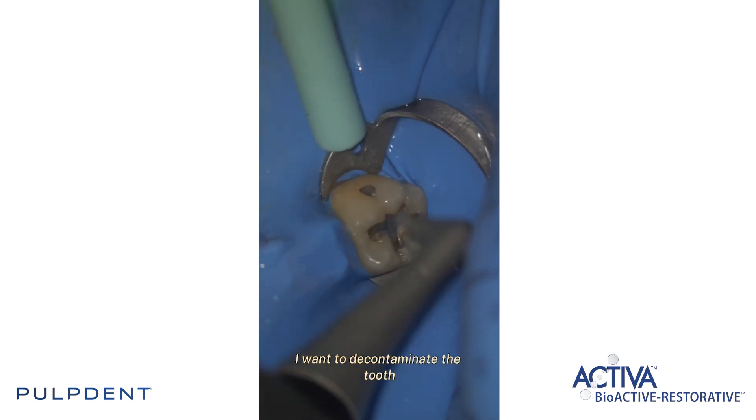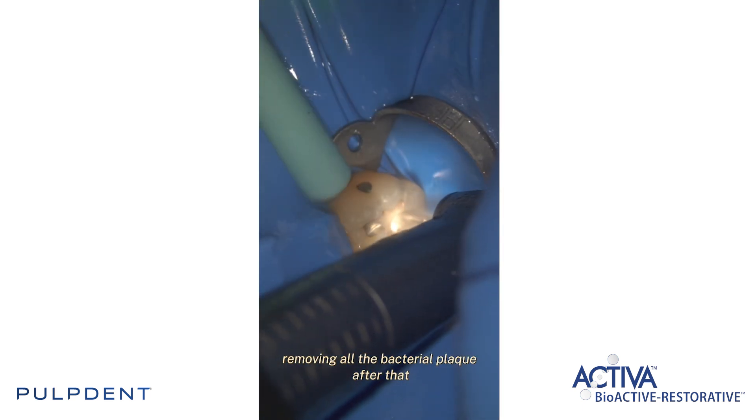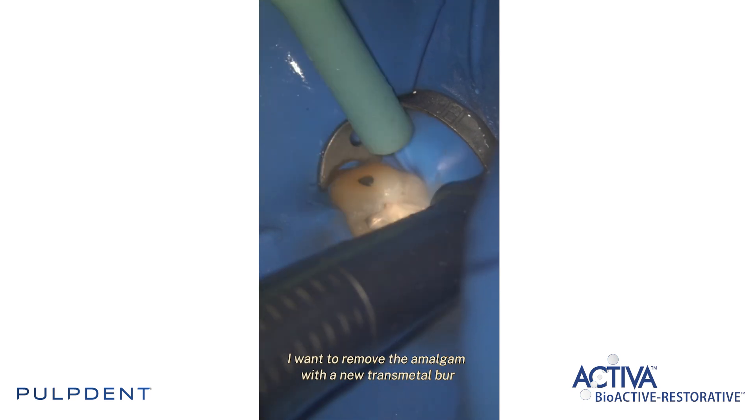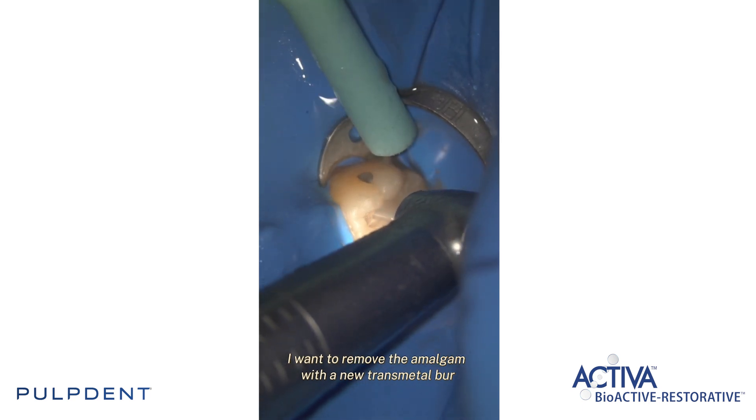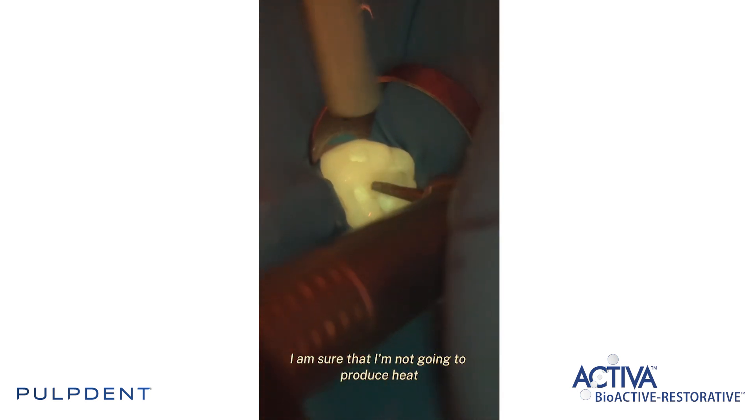First of all I want to decontaminate the tooth, removing all the bacterial plaque. After that I want to remove the amalgam with a new transmetal burr. In this way I am sure that I'm not going to produce heat.